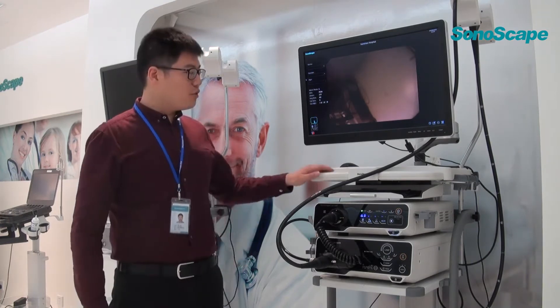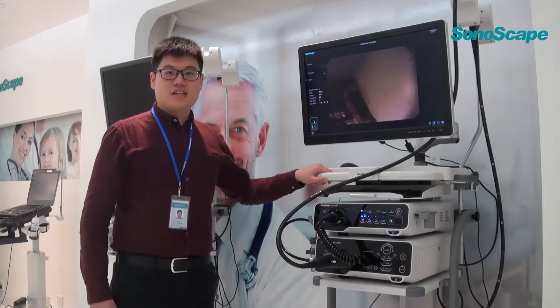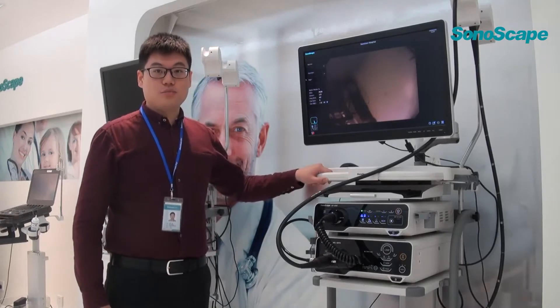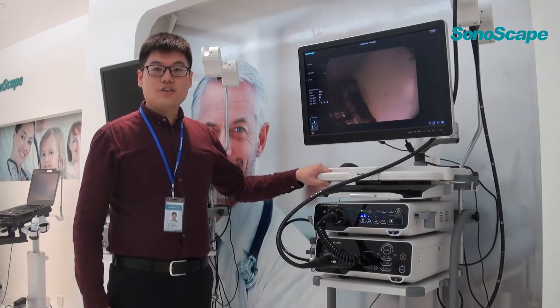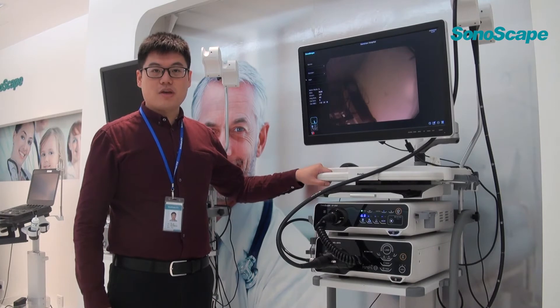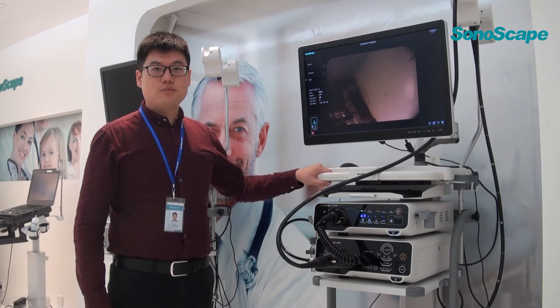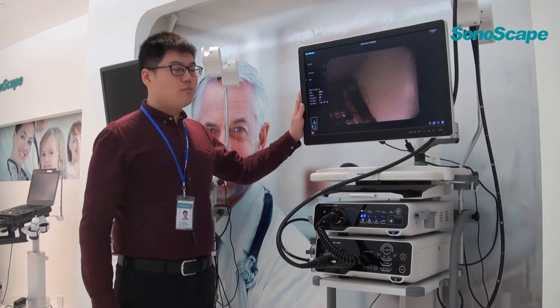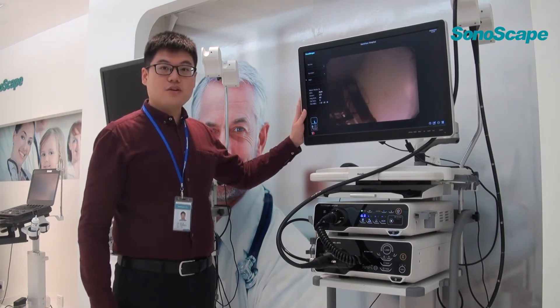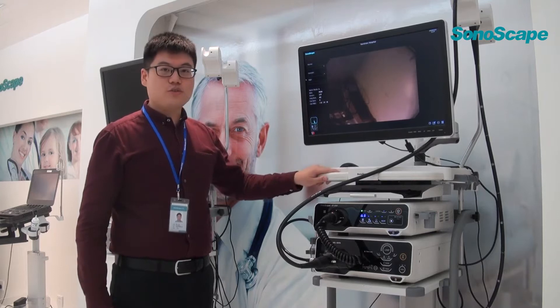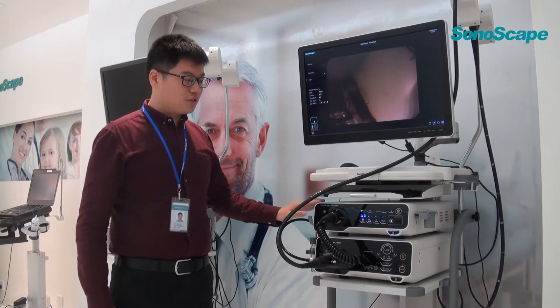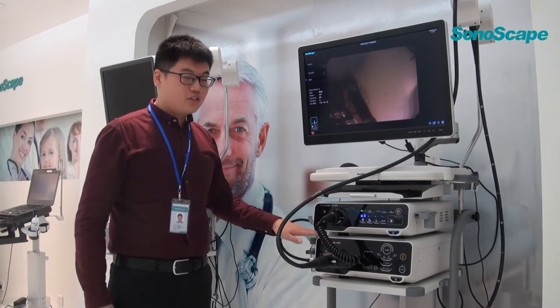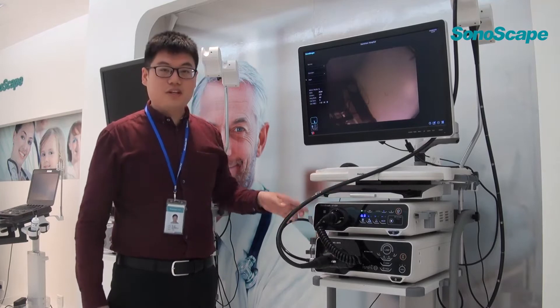As we know, HD500 is our high-end model. The standard configuration includes five main parts, which are LCD monitor for medical use, multifunctional trolley, image processor, light source, and endoscope itself.